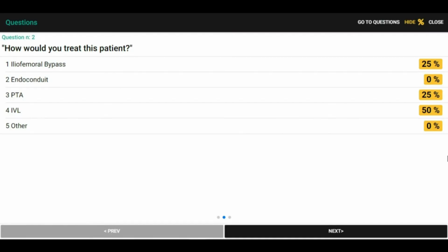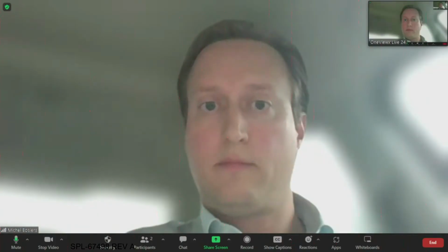Yeah, probably one comment, Michel, looking at these results and these poll. You showed us how sometimes the endoconduit and paving cracking is not the solution. So in your first case, you showed us how after the rupture you used the endoconduit, but then you were not able to cross the stent, and you had to perform an iliacofemoral, so an open conduit.